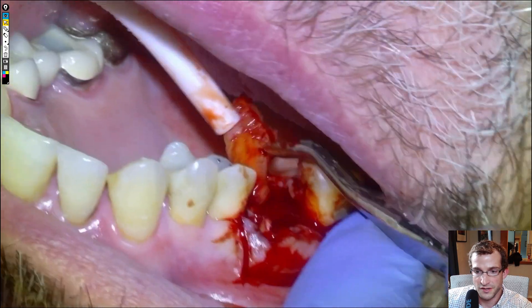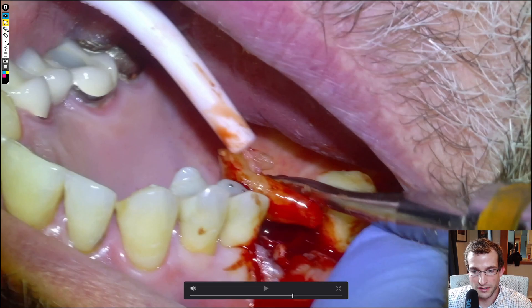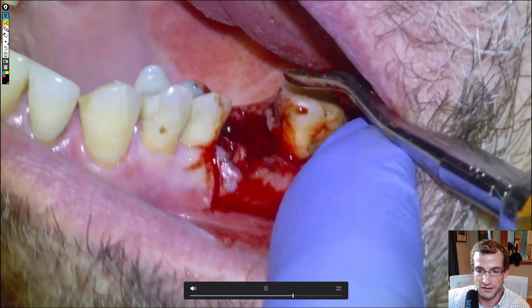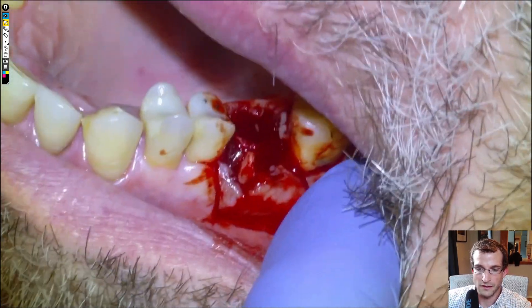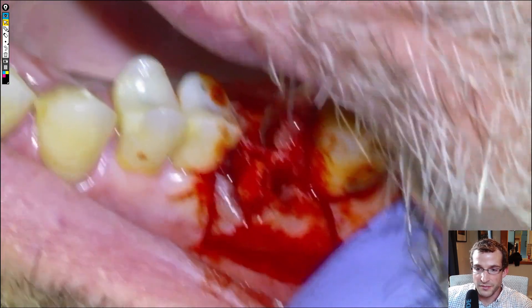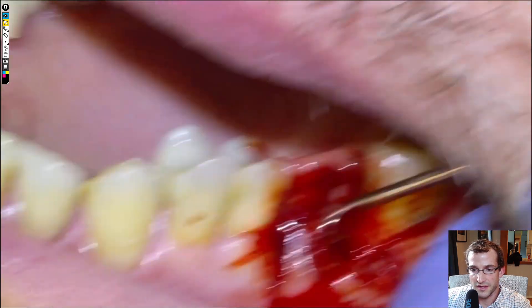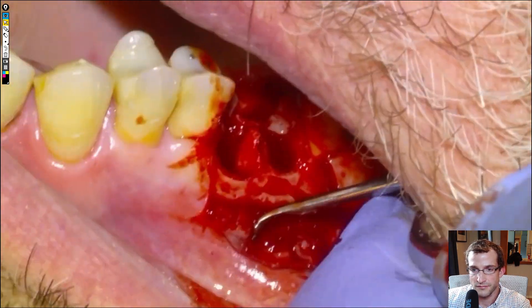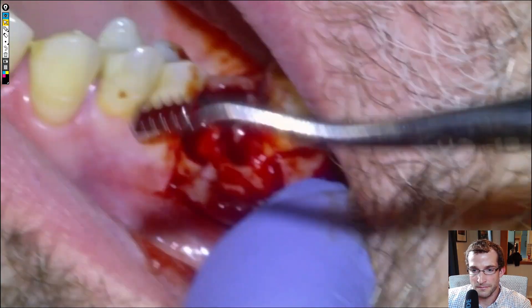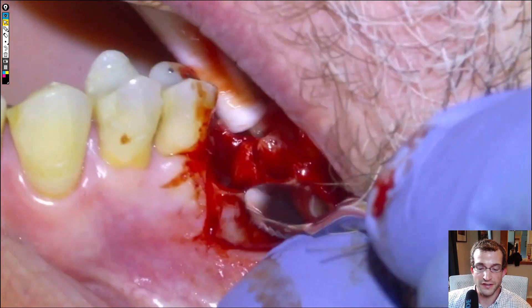Then we're finished with the extraction, so we'll clean up the site. You can see that bit of interproximal bone is going to be a problem for the tongue because we're not grafting and we're not going to be placing a membrane, so we'll grab a bone file and just rasp that down flat. Then grab the curette and poke around. The apices are root treated with no lesions, so there isn't really going to be any granulation tissue at the apex of any of the roots.